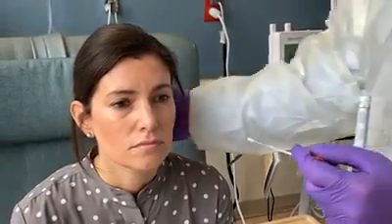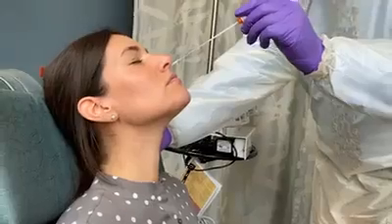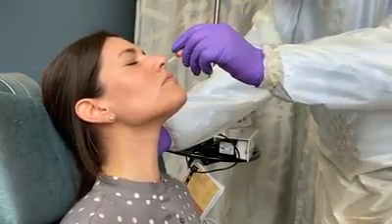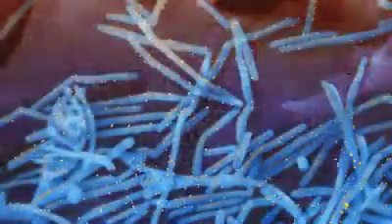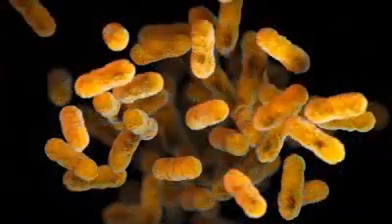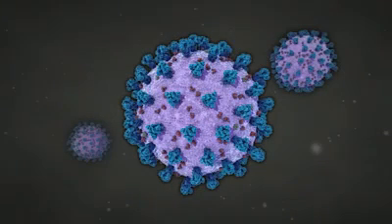Collecting specimens from the surface of the respiratory mucosa with nasopharyngeal swabs is a procedure used to diagnose COVID-19 in adults and children. The procedure is also commonly performed to evaluate patients suspected of having other respiratory viral infections or certain bacterial infections. This video describes collection for detection of COVID-19.